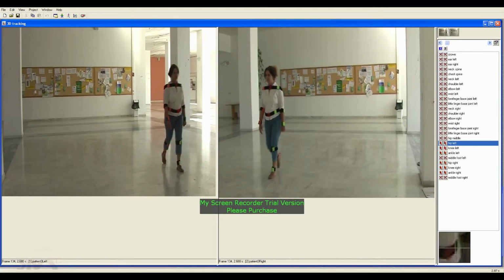By doing this for every desired joint and for every frame of the recording, we are able to acquire 3D motion data which describes human gait and therefore reproduce an animated 3D representation or even use that information to calculate meaningful kinesiology metrics like the ones which we'll be presenting consequently.